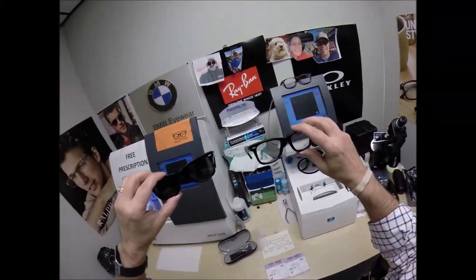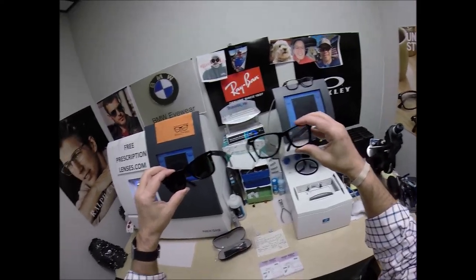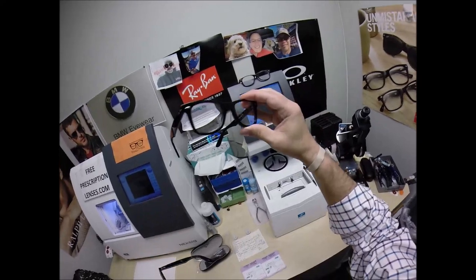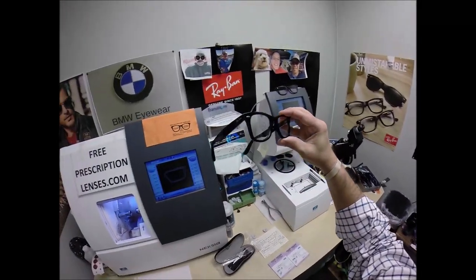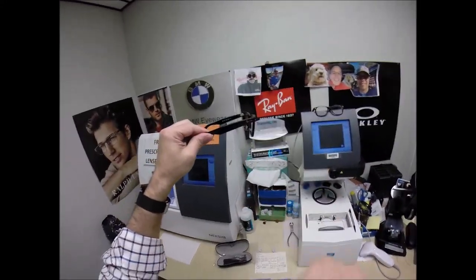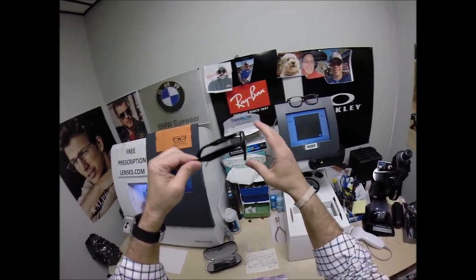Probably somewhere around 2010 or 2011 they came up with the ophthalmic version. The ophthalmic version is designed to have lenses put in it — not that you can't put lenses in the sunglass version, but for a long time people just didn't. With that geek chic look they came out with the 5121. It's got that classic pantoscopic tilt, meaning the bottom of the lens comes inward from the cheek.